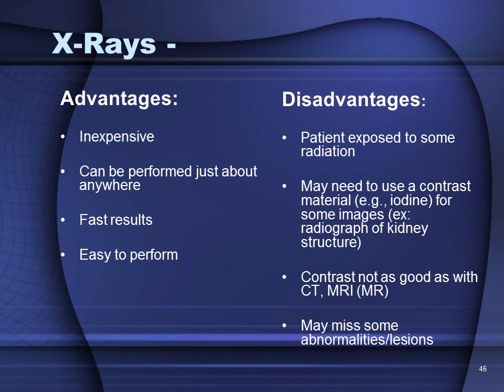Contrast is not as good in an X-ray as you see in a computed tomography, a CT scan, or an MRI. And sometimes you may miss some abnormalities or some lesions that might be better visualized using these other techniques.